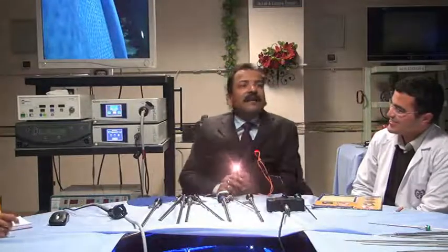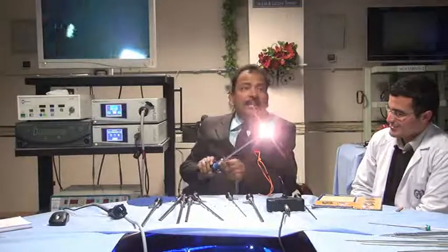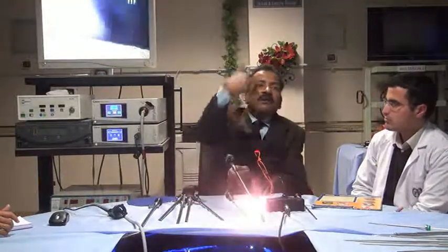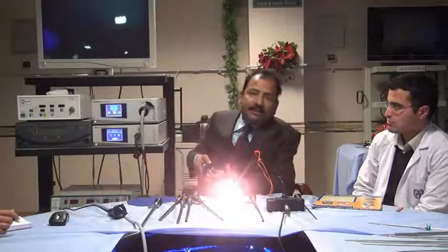So the light is going from below and the shadow is up. Exactly the same way, even in 0 degree, if you put the light below, then the shadow of the gallbladder will go on the liver. And your performance will deteriorate.